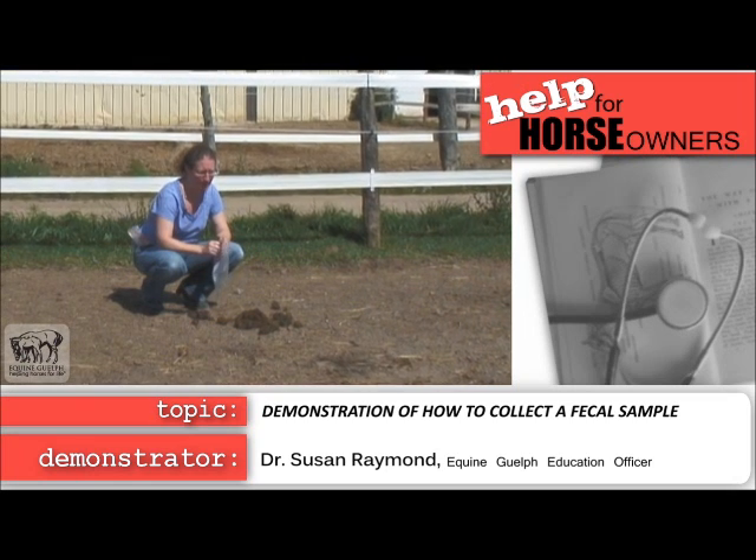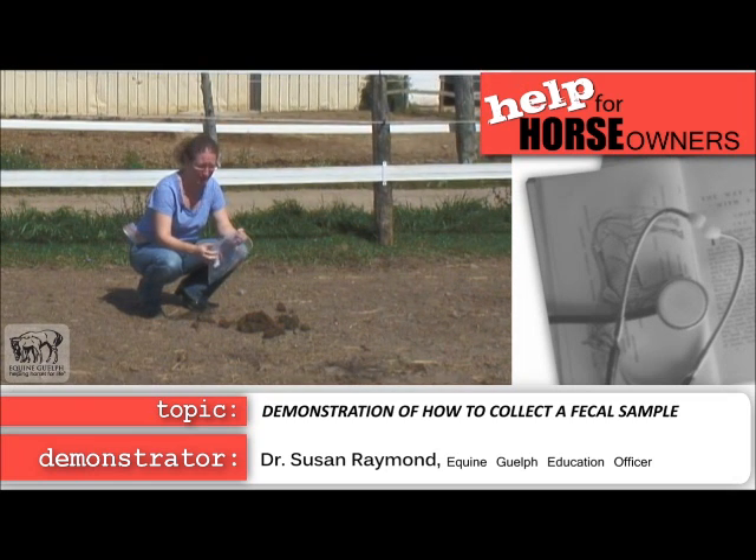Today we're going to be collecting a manure sample for your fecal egg count. You take a Ziploc bag and put it inside out with your hand inside.